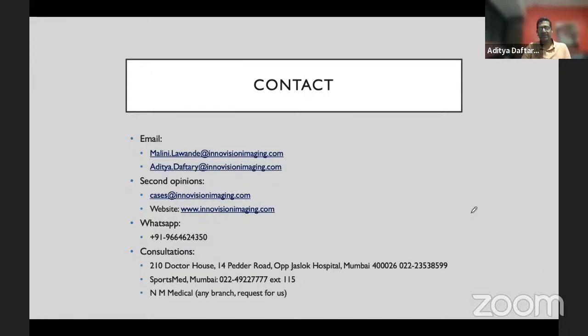The first question is, what is the best time to do an MRI? Do it early or later? The first thing is that oftentimes we don't have control over when the MR is done. But if you were to think about it, I think 48 to 72 hours post-injury is a decent time to do an MRI, especially if you're trying to determine what's going on, not over- or underestimate. If you find things that are particularly abnormal, like an MCL sprain or an ACL that looks like an intermediate grade injury, then it may be a good thing in these situations.